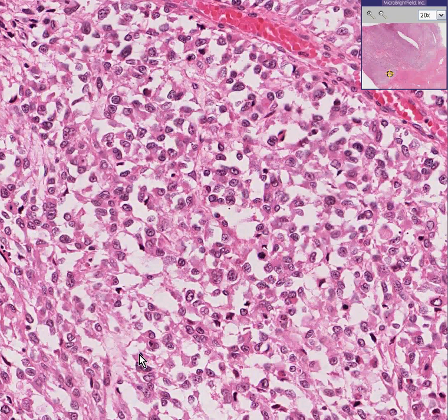In this field right here, here's one, here's one, possibly this is one, probably these two are as well, maybe this is one. So in just this one field, we found four or five mitoses, whereas we could study 10 fields of normal muscle and usually find none.